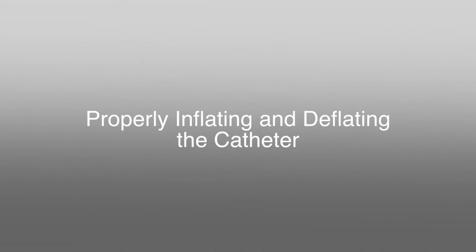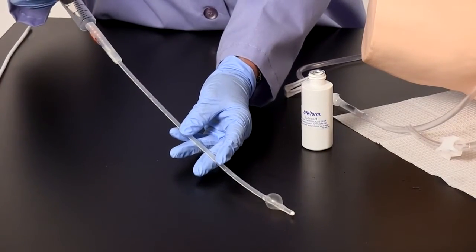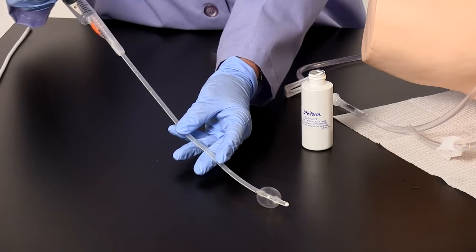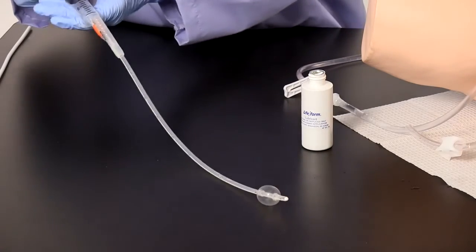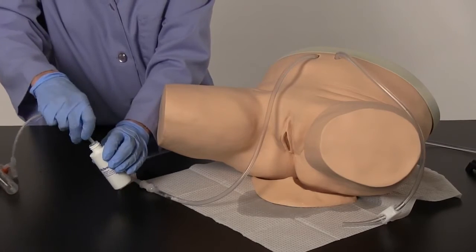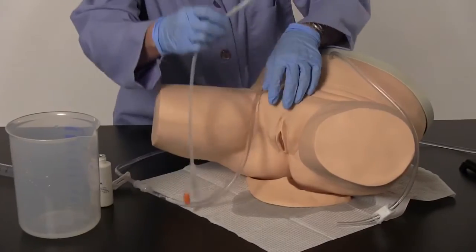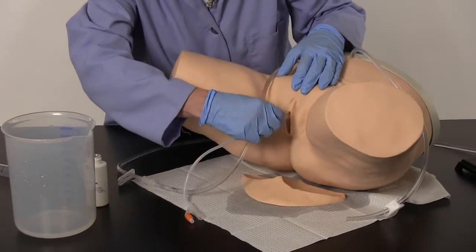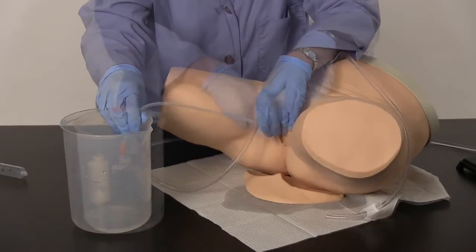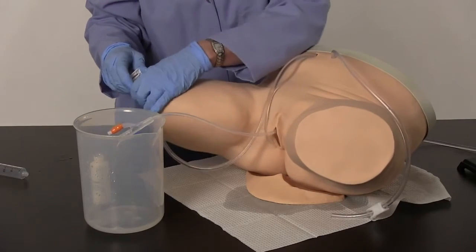Properly inflating and deflating the catheter. Special care should be taken when using a Foley catheter. Cuff inflation should only be attempted when it is in the proper position inside the bladder. The cuff must be completely deflated before the catheter is removed. A 20cc syringe will be needed for this procedure. The syringe shown is not supplied. To restrict the flow of water when inflating the cuff, slide the clamp closed on the fluid administration set.